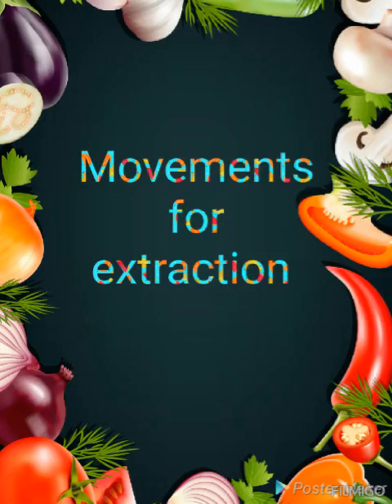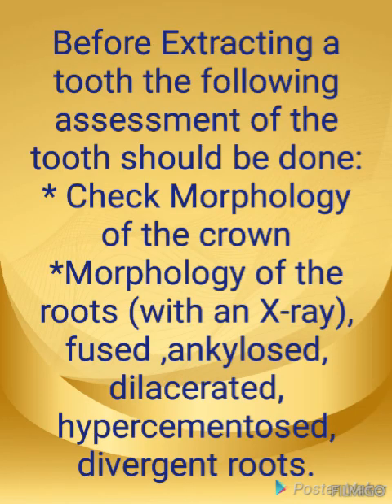Let's see about movements for extraction. The movements for extraction are very important. Before extracting a tooth, the following assessment of the tooth should be done. First, we have to check the morphology of the crown and the morphology of the roots with an X-ray, to see if it is fused, ankylosed, dilacerated, hypercementosed, or has divergent roots.